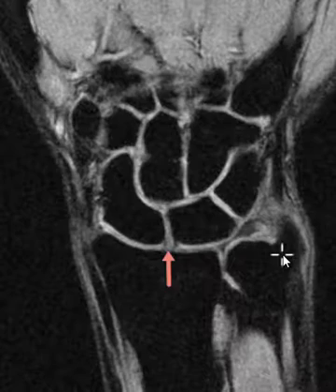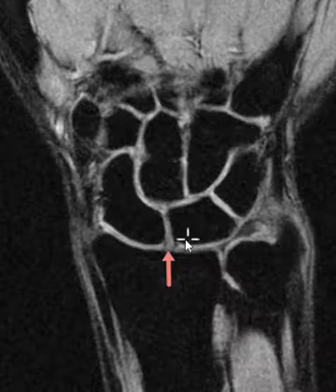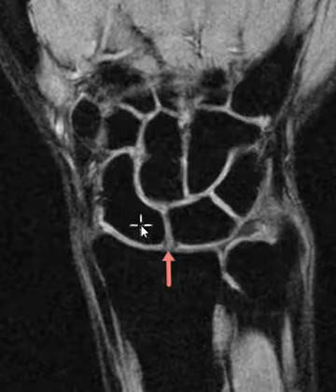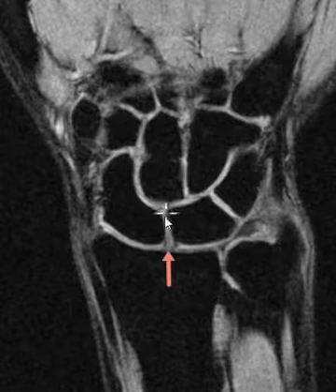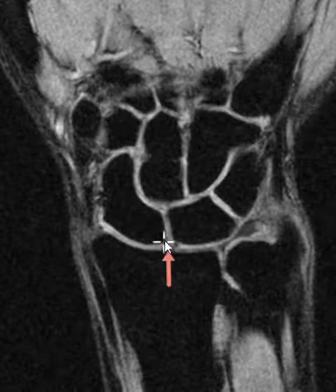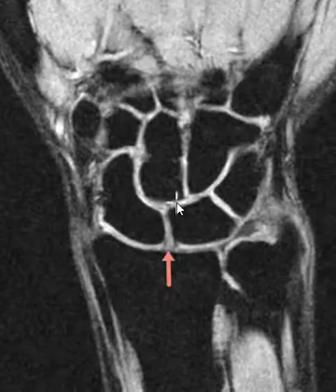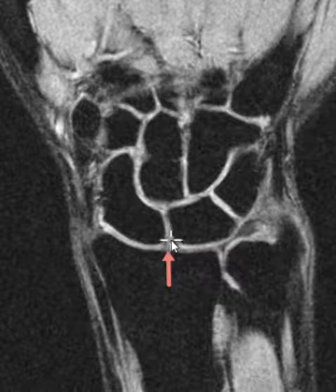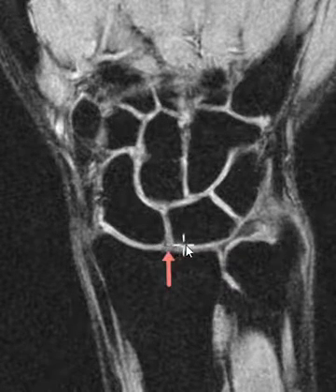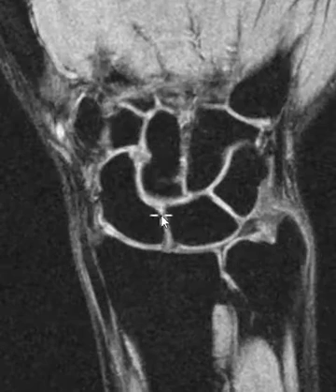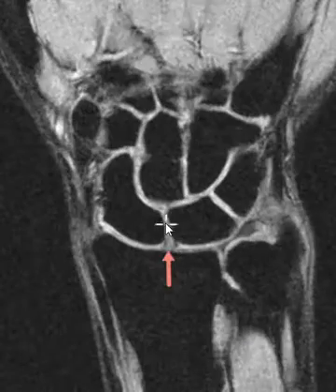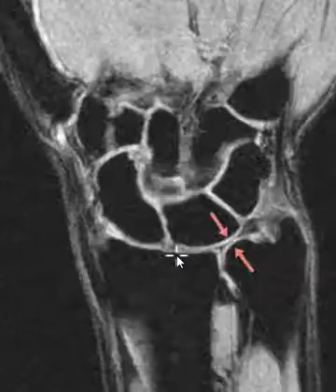Here are some arrows on one finding and an arrow on the other. This first finding is between the scaphoid bone and the lunate bone. We should see a little black triangle here called the scapholunate ligament — a little black wedge right in between — and instead we do not see it. We see a vertical band of bright signal. It looks like the joint coming down, so this is the scapholunate ligament and it is torn — a longitudinal tear right through it.